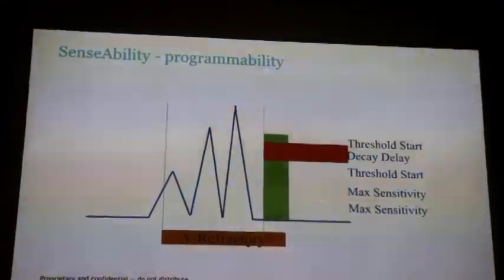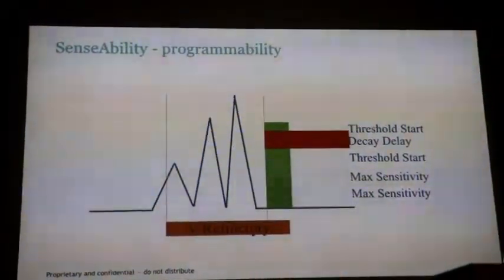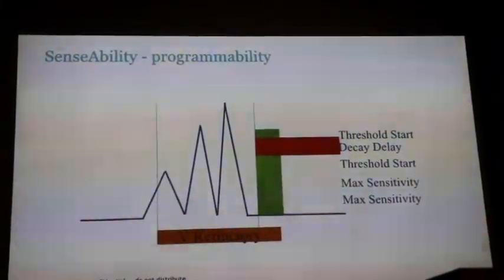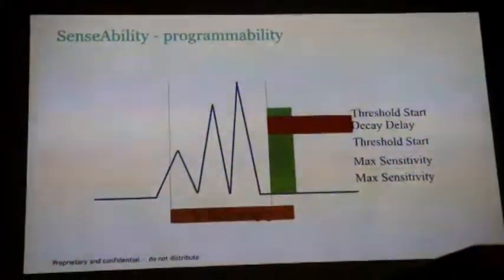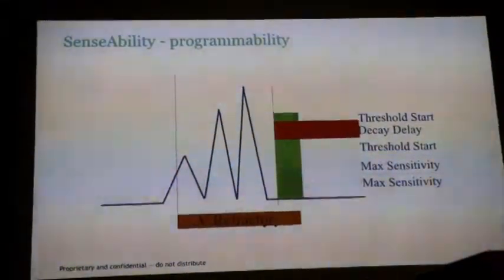This we would normally change if you're sensing diaphragm. You can sense diaphragmatic signals with ICDs. Anyone seen it? No. Okay, I'll show you. You've seen it. Okay, I'll show you it later as well. We've got a couple of nice cases.